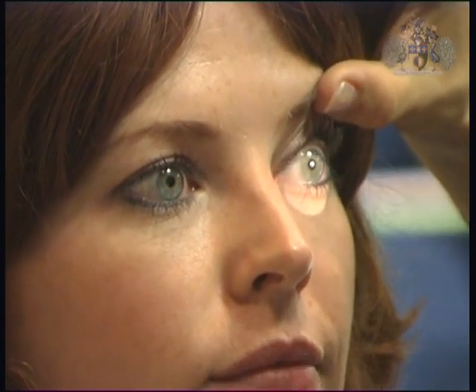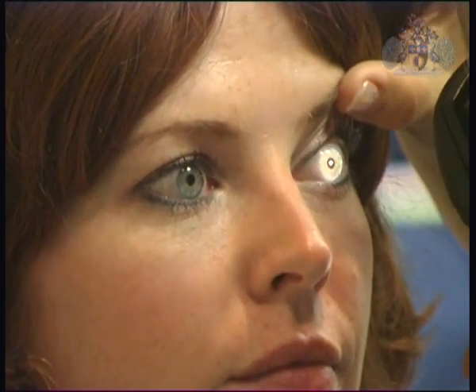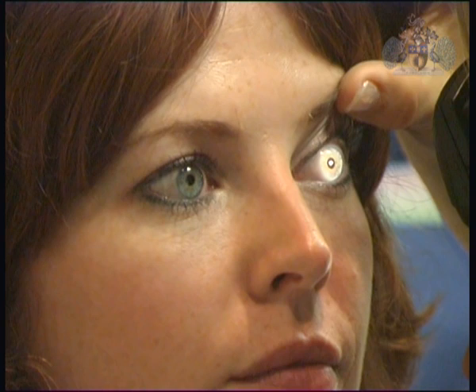In an exam scenario, the only situation in which you will be permitted not to use your left eye is if you have evidence from an eye care specialist that you have left amblyopia or lazy eye, and you need to be examined through the University Health Service. Similarly, the same applies to the right eye if you have right amblyopia.